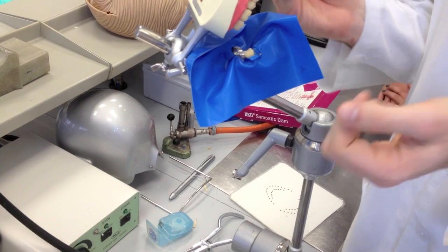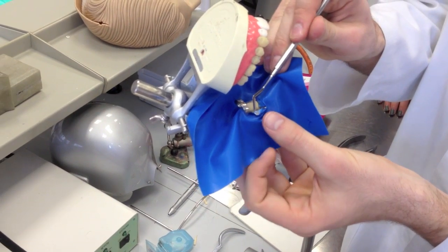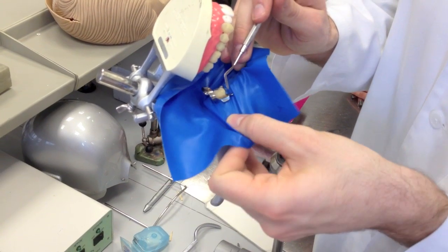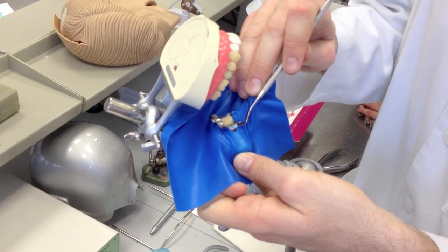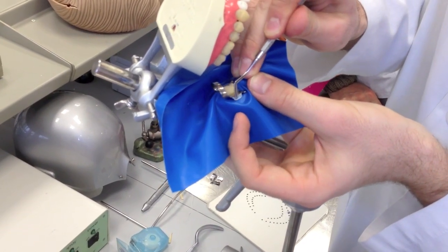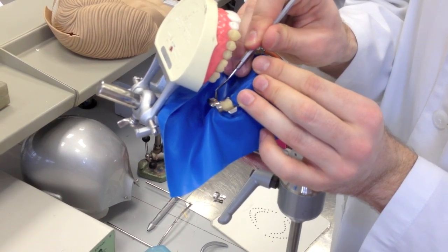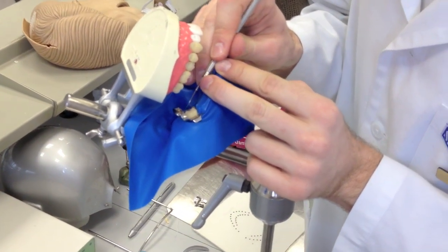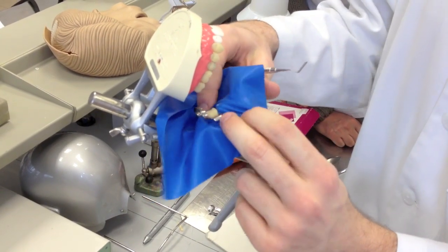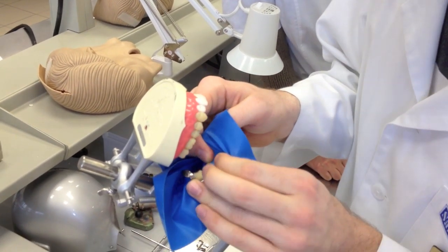After placing the clamp and rubber together, the first step is to use a non-sharp instrument to remove the rubber from the wings. You can see even this instrument can tear it — this is quite a hard type of rubber sheet. If you have a more elastic, soft one, it is much easier to remove. Then the rubber is removed from the wings.